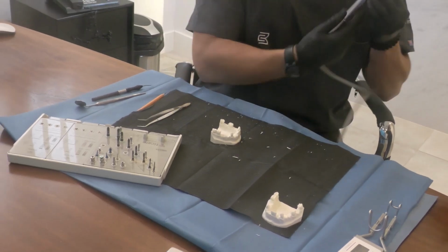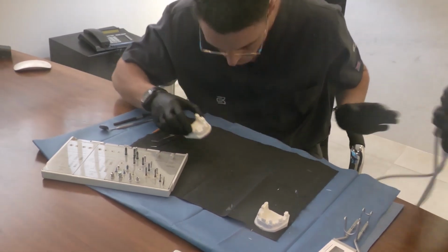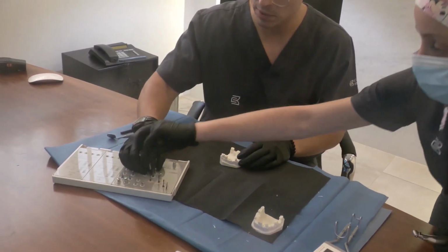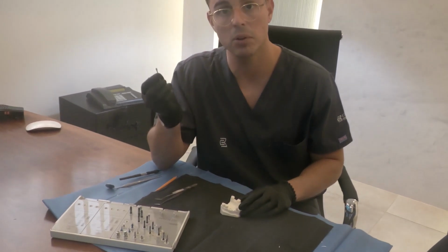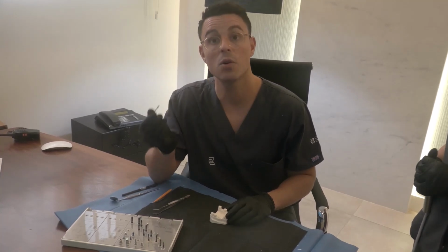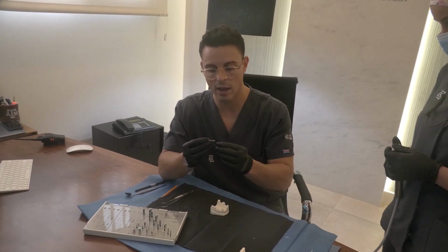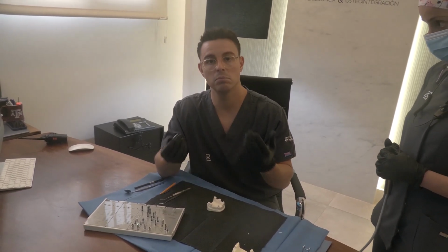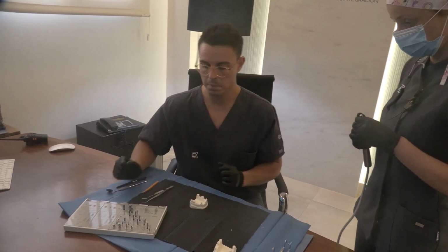And now the last step, which I believe is really crucial, is going to be using the profile bur. Okay, the profile bur will minimize the trauma and will minimize the friction during insertion in the coronal area, which is always going to be the more susceptible in order to have changes in the short and also in the long run.